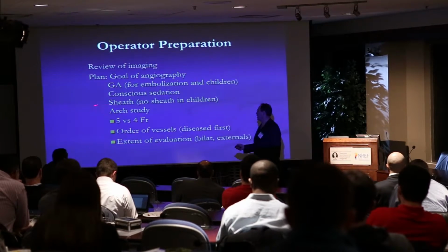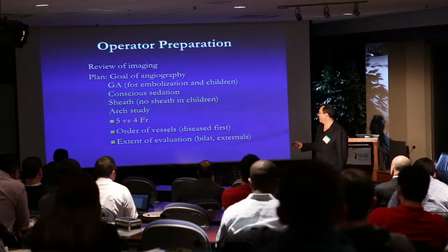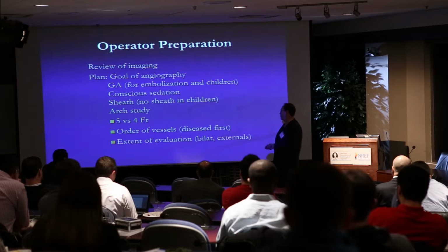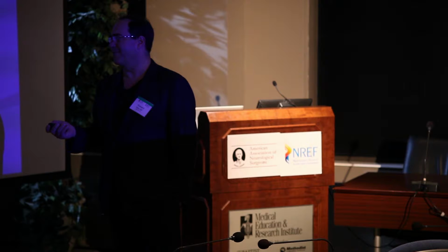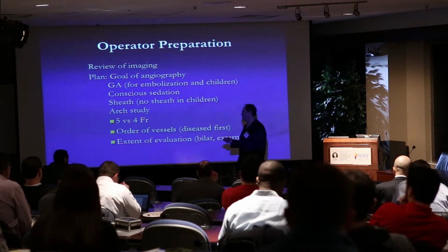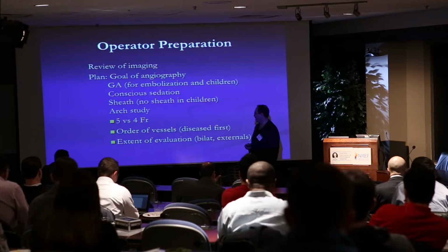Particularly, you'll hear at the cardiology meetings. There isn't an interventional cardiologist I know that doesn't start his procedure, at least once in the care of a particular patient, with a study of the arch. I almost never do that. A lot of our MRAs and CTAs will have good images of the arch, unless I'm forewarned that it's some particularly difficult or elderly patient. I usually don't go looking at the arch beforehand.